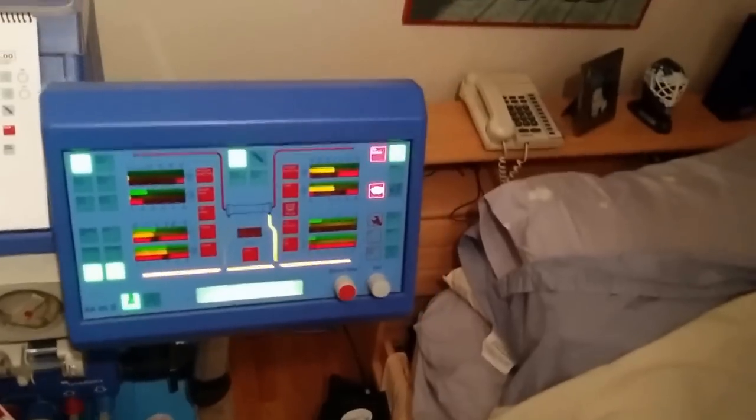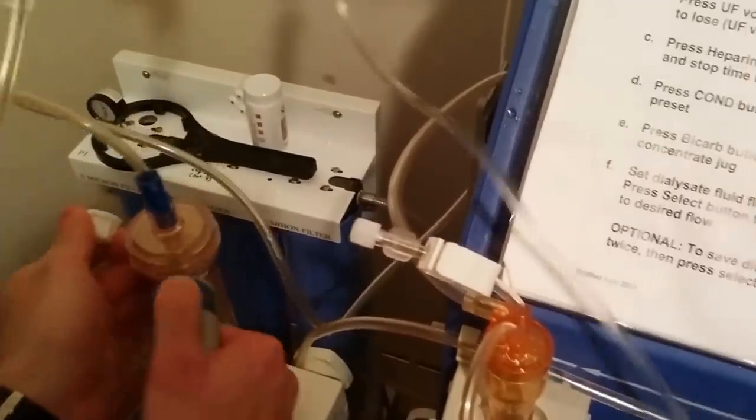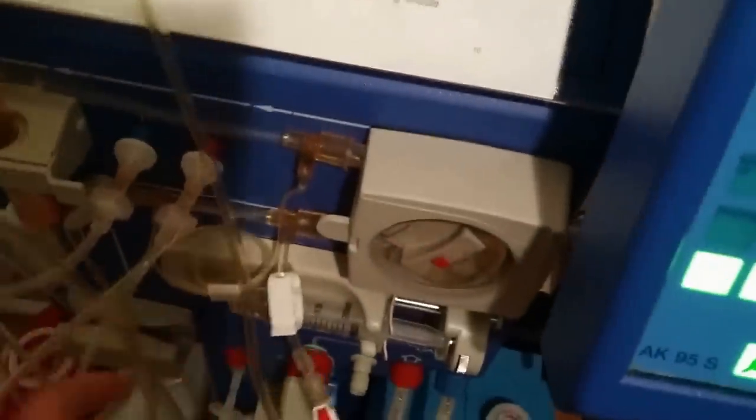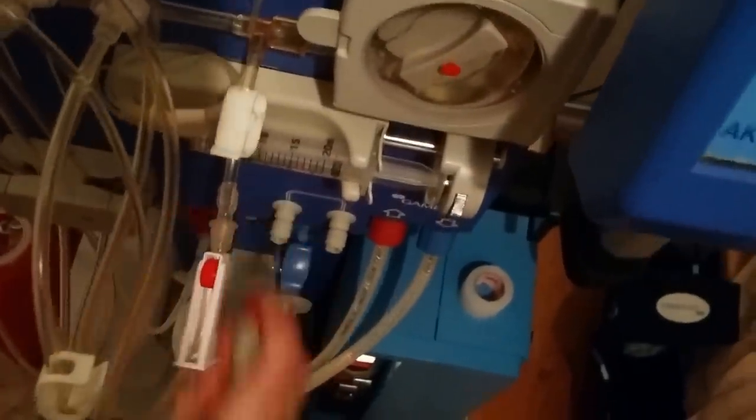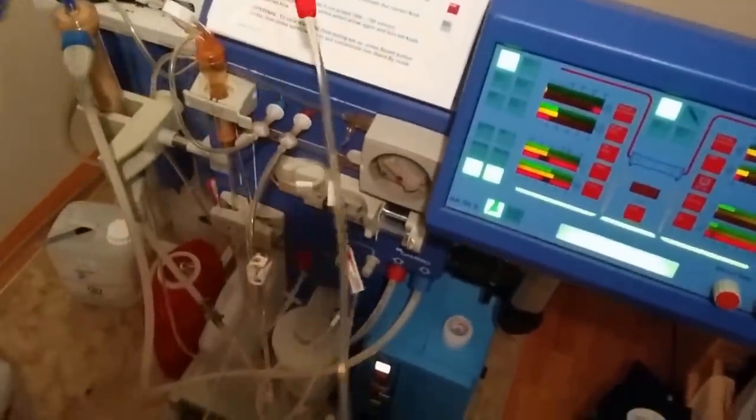We need to wait for the conductivity to get all set up — there's a red line along the bottom of the screen. The conductivity is basically the acid jug and the bi-cart that we connected at the beginning; we have to wait for that all to mix. Once we get the green light, we can go ahead and connect the dialyzer fluid hoses to the dialyzer. Then I unclipped the arterial red clamp and turned on the blood pump, so now we have saline flowing through the machine.